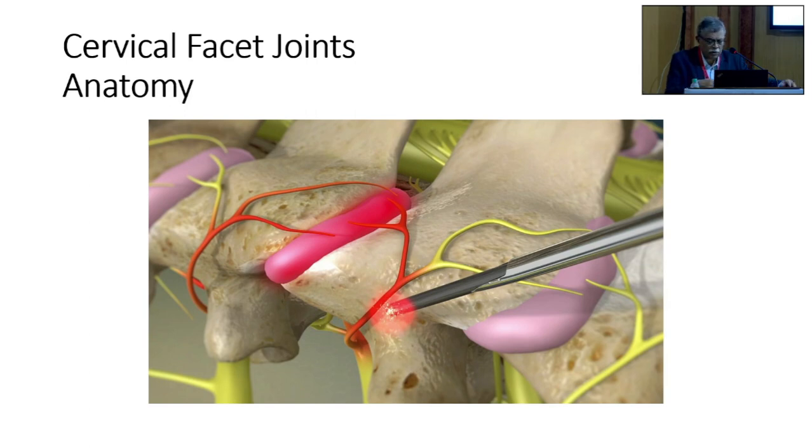The anatomy, of course, all of you know that this is the joint supplied by nerve from below, nerve from above, as we were discussing. This is the branch from the dorsal ramus, and the joint has a capsule, joint has a synovium, so there is a synovial fluid too. Sometimes when you have a facet arthropathy, you can withdraw fluid, and there is an effusion, and just decompressing the joint gives a fantastic relief to the patients. And if it is persisting, then we knock off the nerves. As you can see, you are doing a radio frequency ablation of one above and one below.